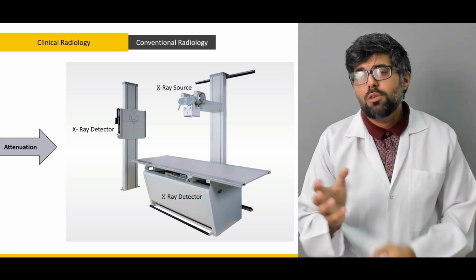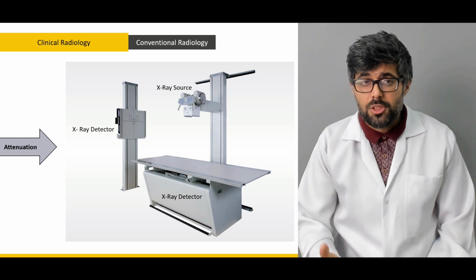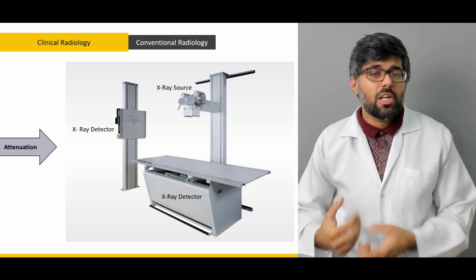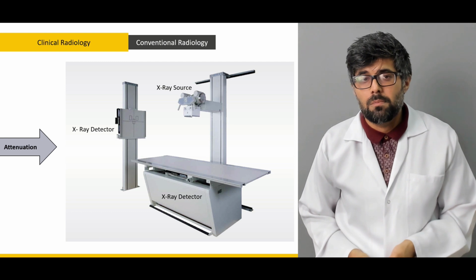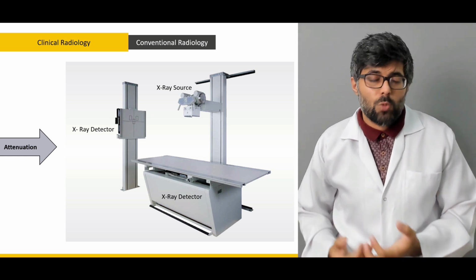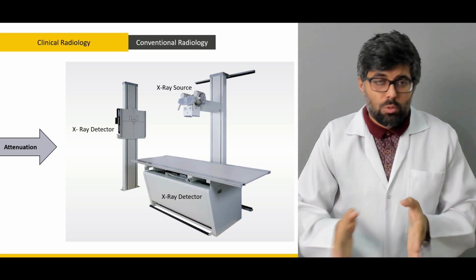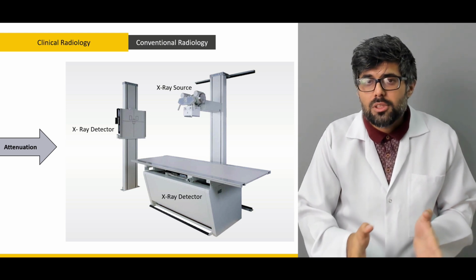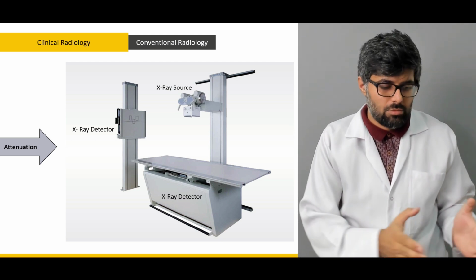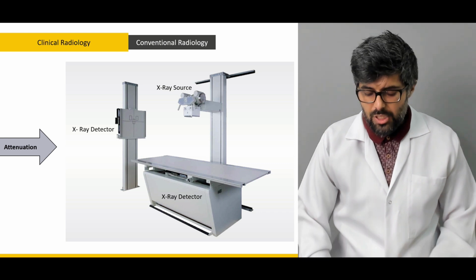Now, conventional radiology works on the principle of attenuation. Attenuation means the differential dispersal of X-rays when they hit our body, because each and every tissue responds differently. Either the X-rays get absorbed, or they get transmitted through our body, or through some tissues some degree of absorption or transmittance happens. This attenuation produces grayscale upon the film, from dark black, through shades of gray, to complete white.